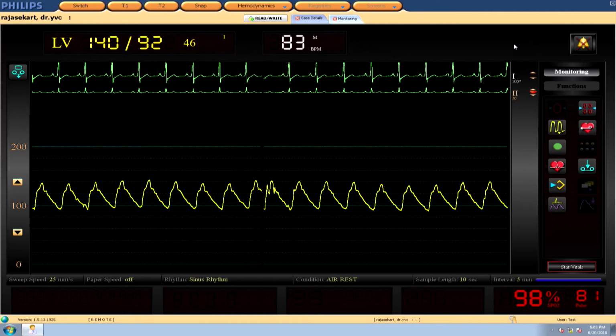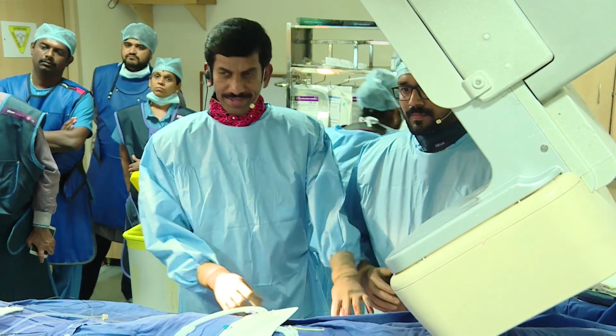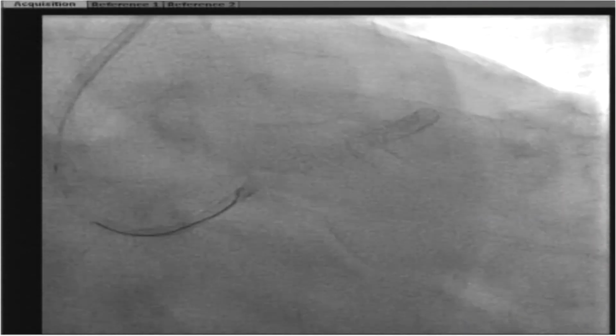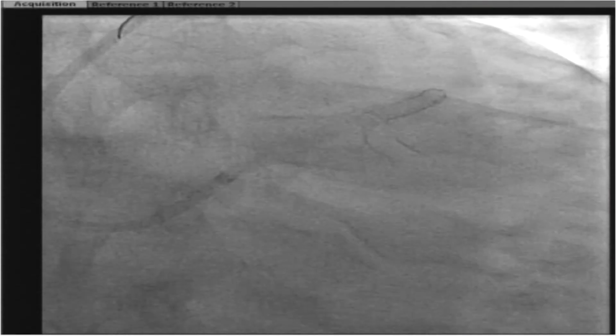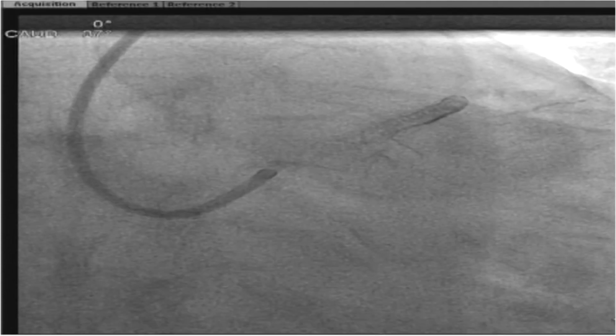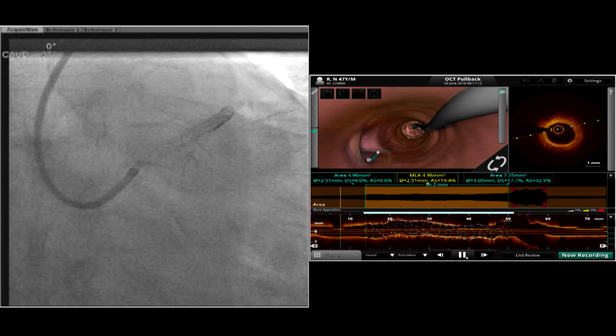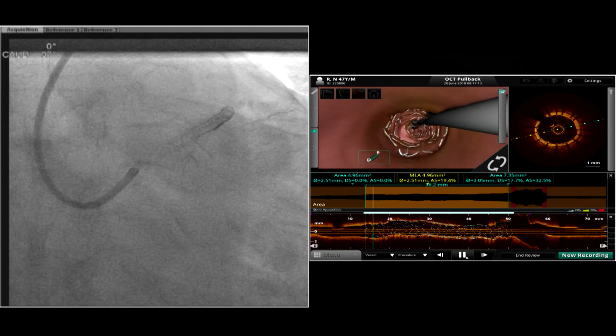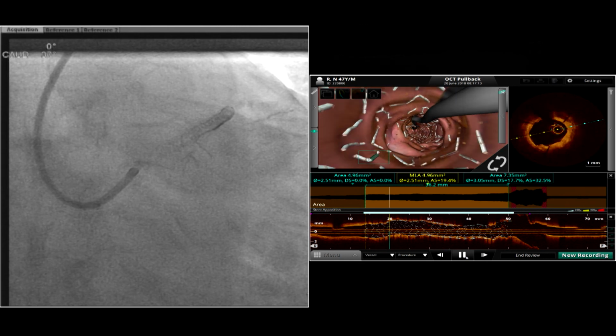So we showed you the 3D advanced display effect, the stent rendering. We showed you the apposition indicator as well, and the post pictures were good, and the fly through of that. The stent is starting distally, so you can see that. That's a very nice result.